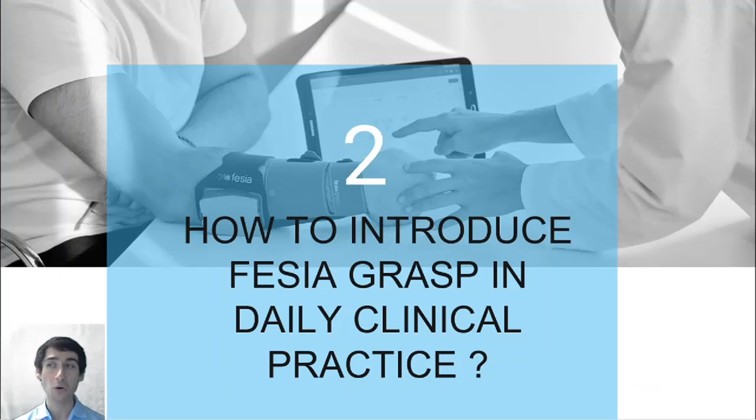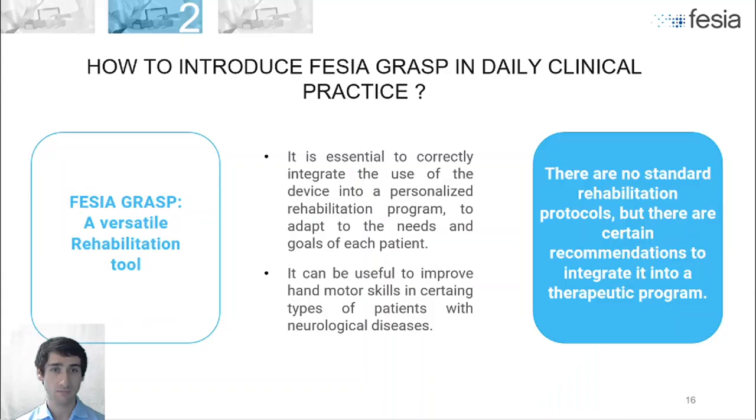Okay, thank you. Now we will go to the next part, the most important one, which is how to introduce Fesia Grasp in daily clinical practice. First of all, I will explain something important: there are no standard rehabilitation protocols, because as in every disease, also in neurological disease, all patients are different, and it doesn't make sense to create standard protocols because they are not going to be adapted to the needs or the goals of each patient and family. Therefore, it is essential to create a personalized rehabilitation program adapted to the needs and the goals of the patients and the patient's environment. And therefore, there are some tips which we will explain now.